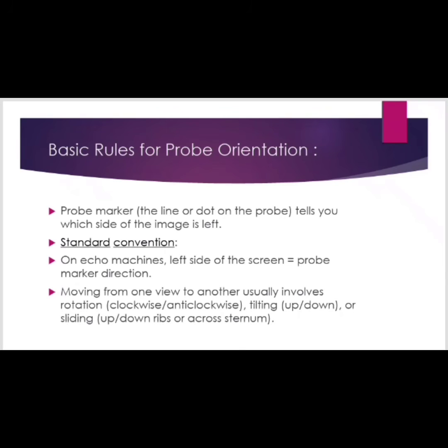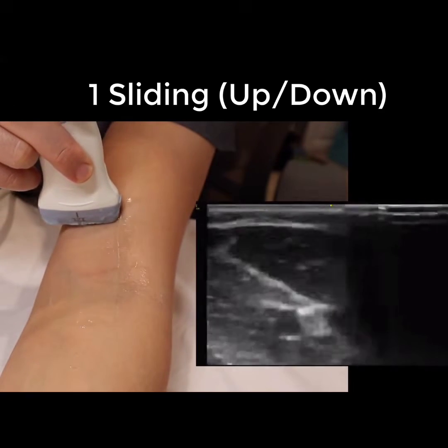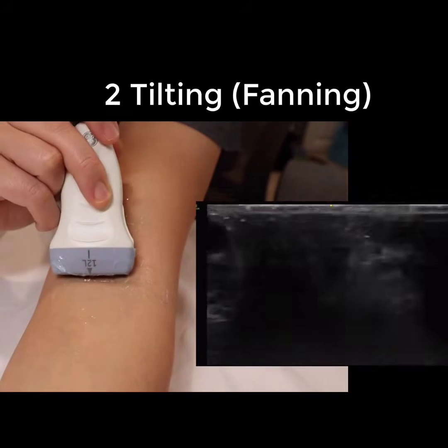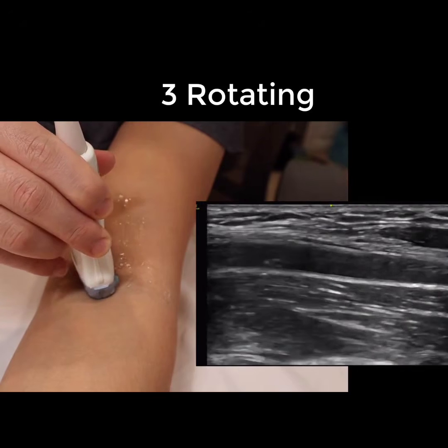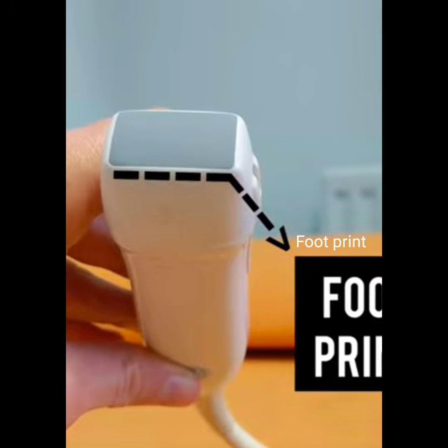Moving from one view to another usually involves rotating the probe clockwise or anti-clockwise, tilting up and down, or sliding up and down. See this to understand. This is sliding: moving the probe up and down, right or left without lifting the probe. This is tilting: just tilt the probe tail without moving the footprint of the probe. And this is rotating the probe clockwise or anti-clockwise. This is the index marker of the probe. Can you see the line? And this is the footprint of the probe.